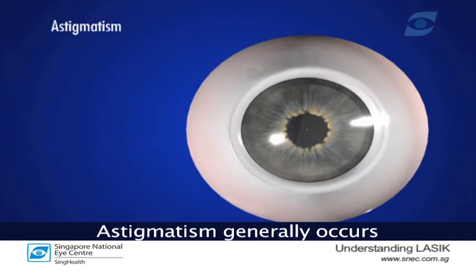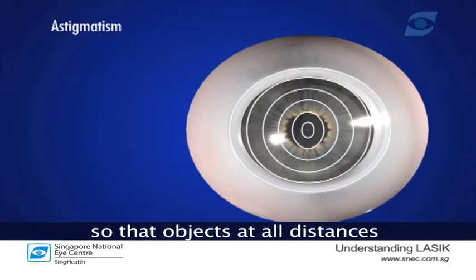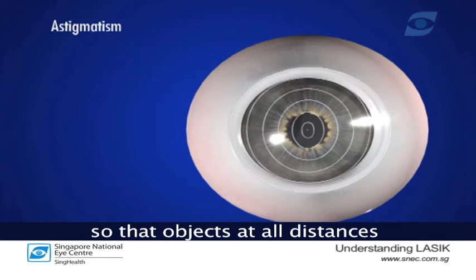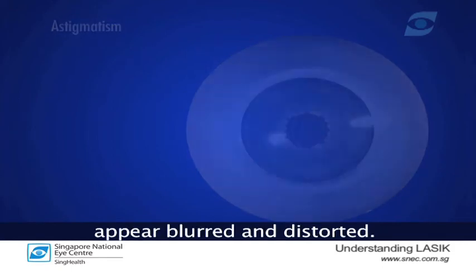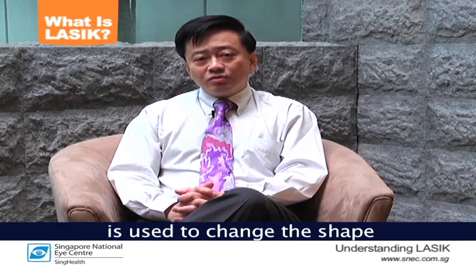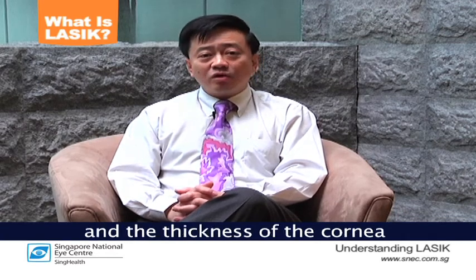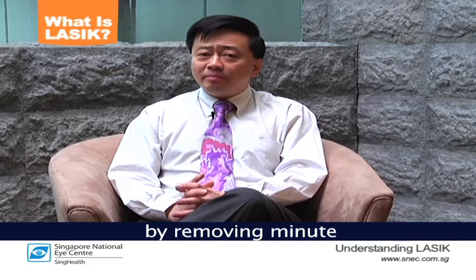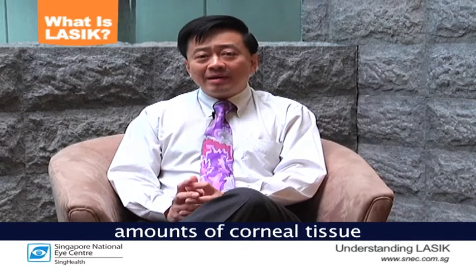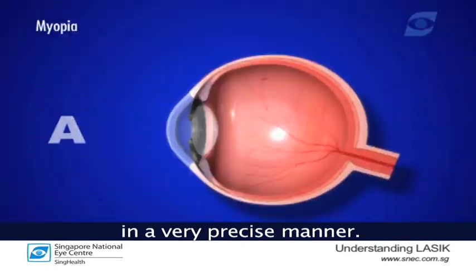Astigmatism generally occurs when the curvature of the cornea is unequal, so that objects at all distances appear blurred and distorted. An excimer laser is used to change the shape and thickness of the cornea by removing minute amounts of corneal tissue in a very precise manner.